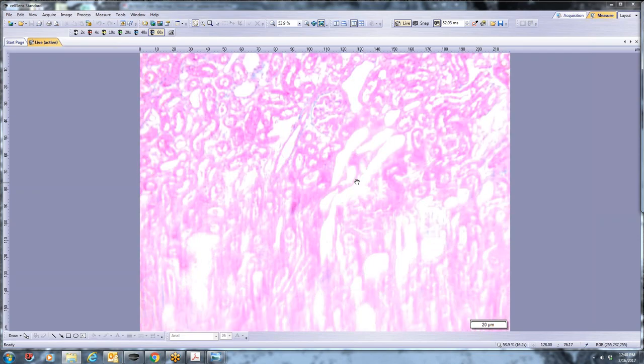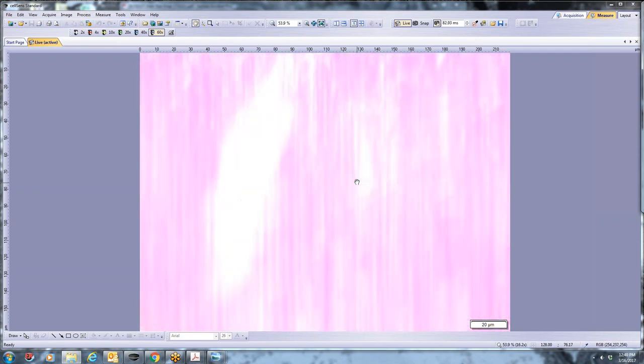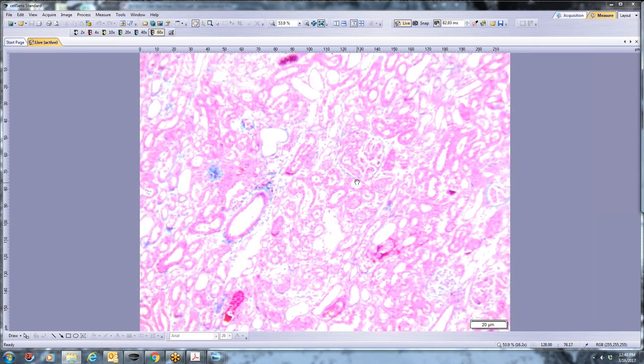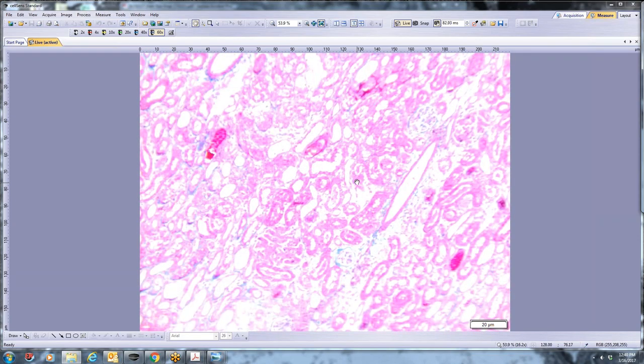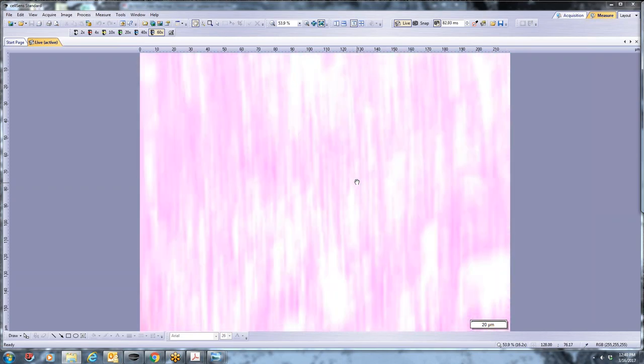There is expansion between one space between the tubule and the next tubule. But all that's due to edema and not necessarily due to accumulation of fibrin or fibrosis. So a lot of this is actually interstitial expansion because of tubular damage and interstitial edema. So it didn't look like an irreversibly scarred kidney. It looked like it was fairly acute.